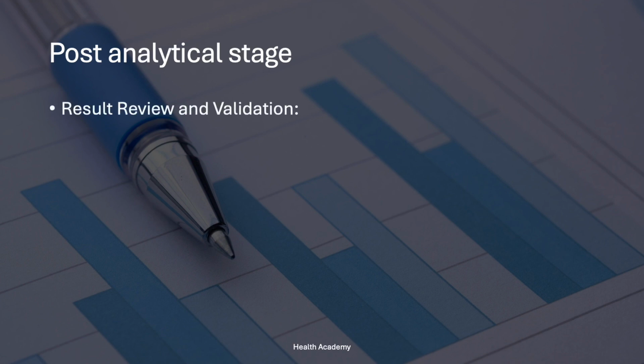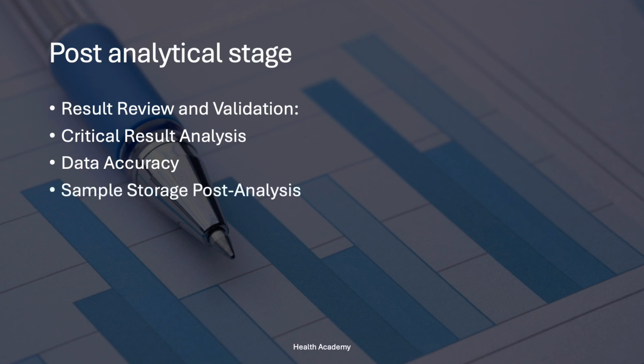Result review and validation. Ensure that all test results are carefully examined and confirmed before their release. Critical result analysis. Gather all necessary clinical information and consider pre-analytical and analytical factors before interpreting critical results. Data accuracy. Cross-check all demographic and patient-specific data such as ID numbers and specimen types to maintain the integrity of test results. Sample storage post-analysis.